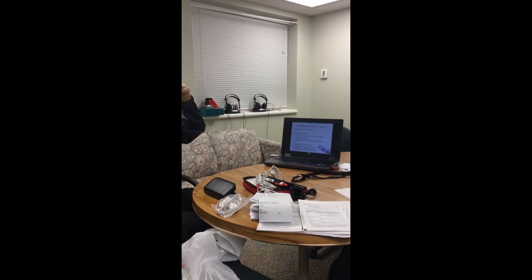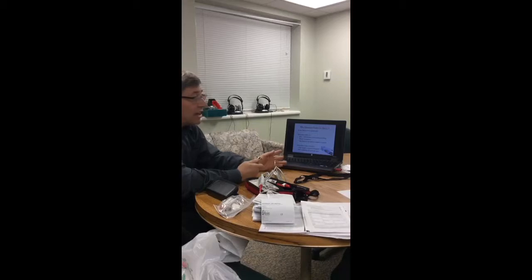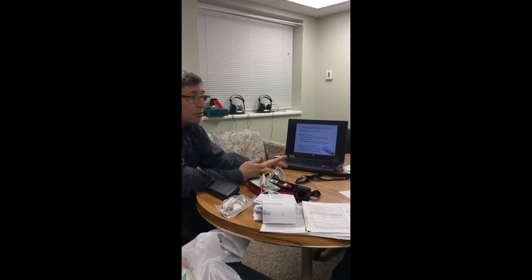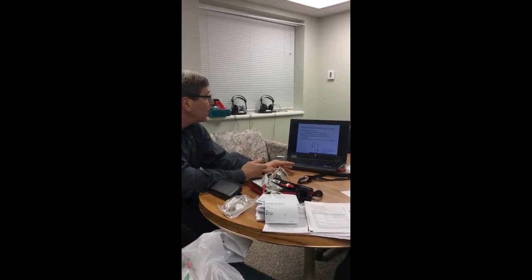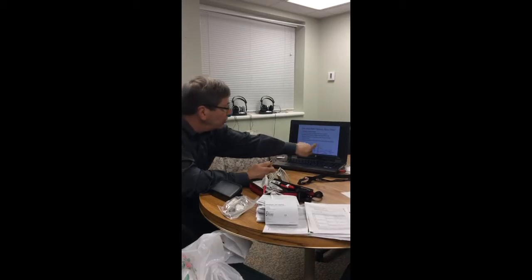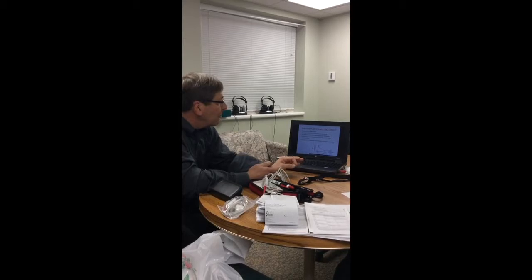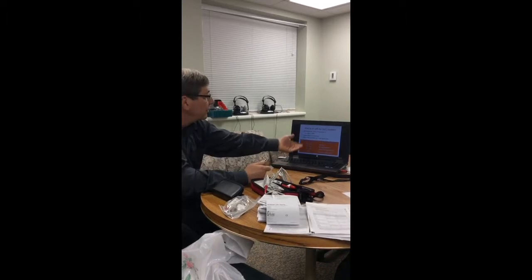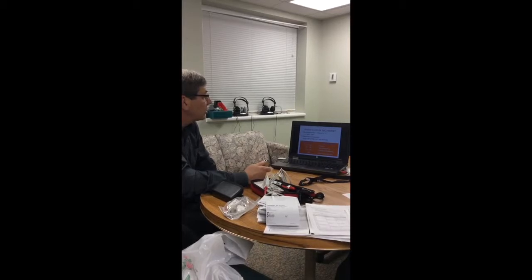So we know that the SpO2 is a total amount of Hb bound to something. We don't know what that something is. What it's not going to tell you is what that something is, and you obviously need to also look at signs and symptoms. What you'll find with CO exposure is the signs don't always correlate. So the way pulse oximetry works, it uses two wavelengths of light, and based on an algorithm that's been established, we're able to measure what the actual sat is. There are some problems with that, and of course these are normal numbers until we get into this range, and then we have to consider high flow oxygen.